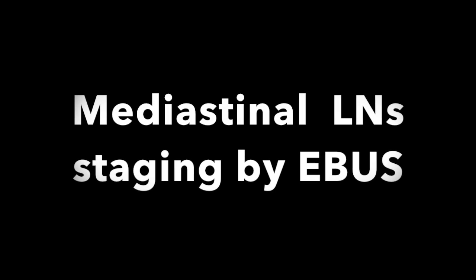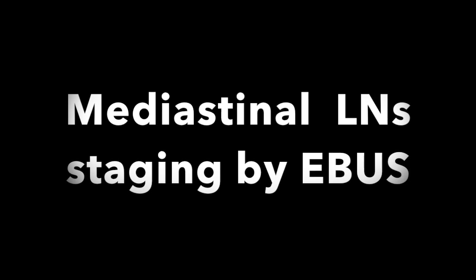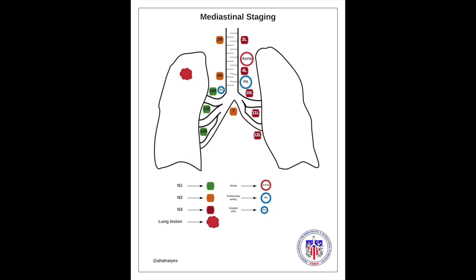We'll continue the mediastinum lymph node staging by EBUS. This is the same scenario for a patient with right upper lobe lung lesion, and the staging will continue from the left side going toward the right side.